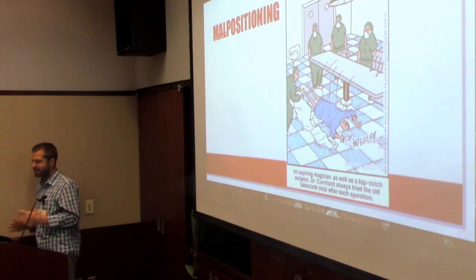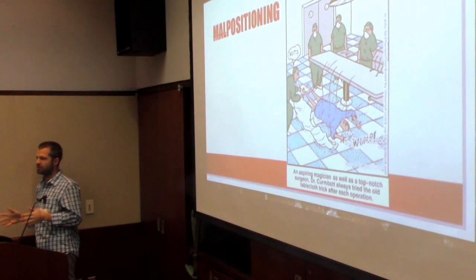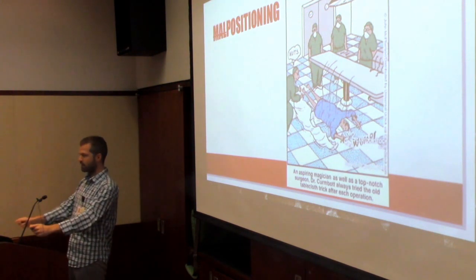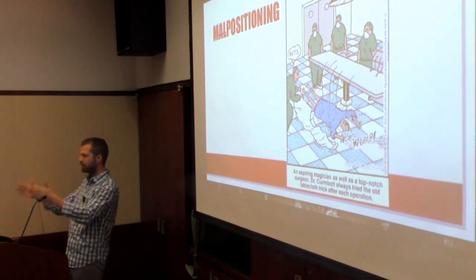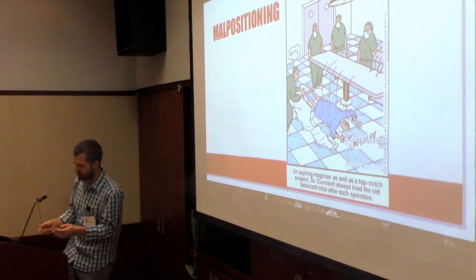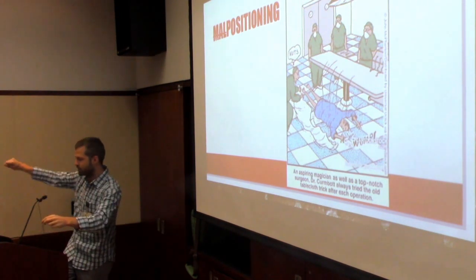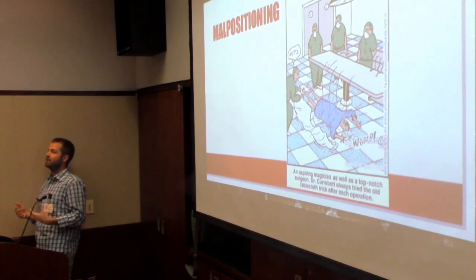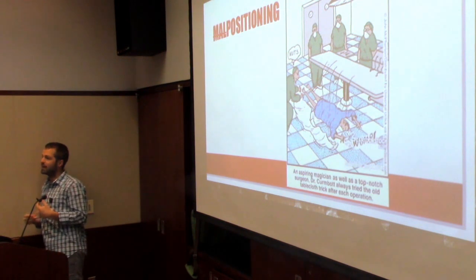My success rate skyrocketed when I put them in a position to not squirm, and put myself in a position where I'm standing, I can see my screen, and my left hand and right hand are all relatively in a 20 or 30 degree view. Sometimes in the ED you don't have a choice. You're leaning over one patient, left-handing, while the probe is over here, and you're looking behind you and doing this. That may be the case at times, but if you have the space and the time, set it all up.